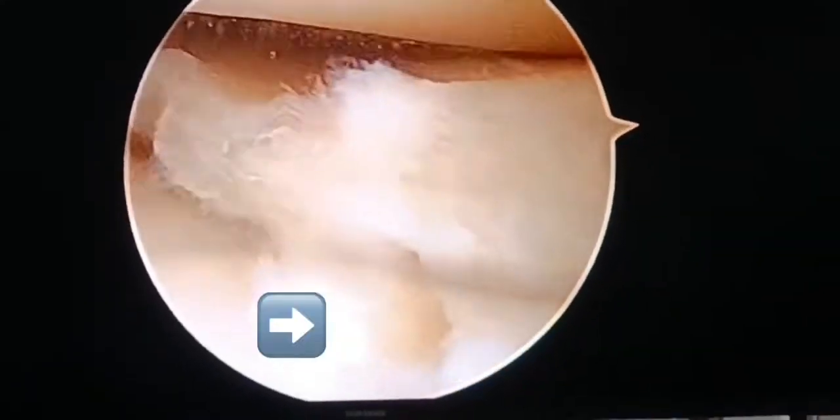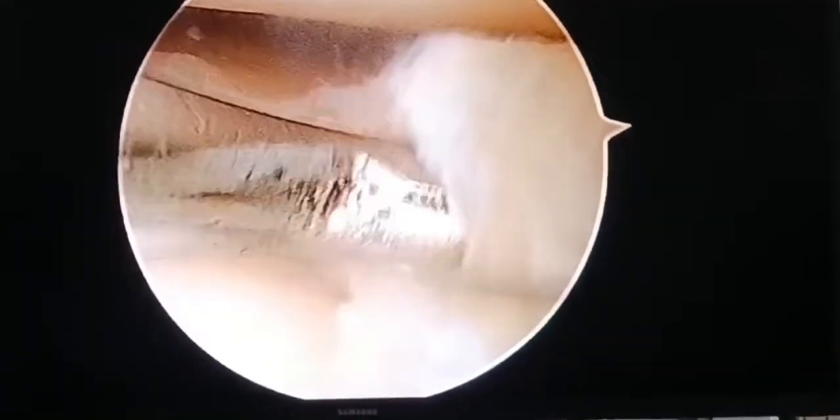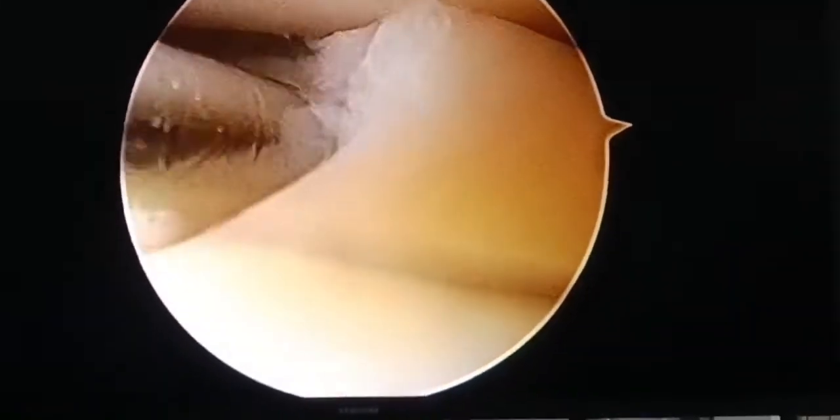Now with the probe we try to identify the rent from where the synovial fluid has extruded out and formed the cyst. We pass the probe deep into that rent and remove as much of the fluid from the cyst as possible.